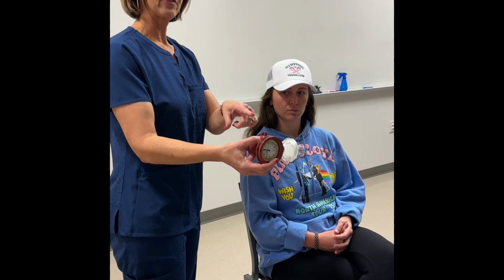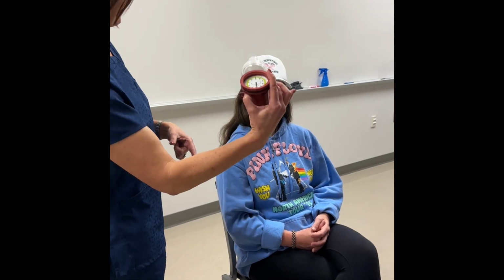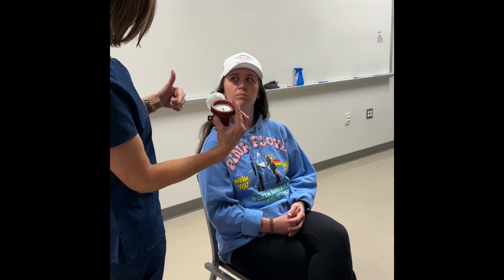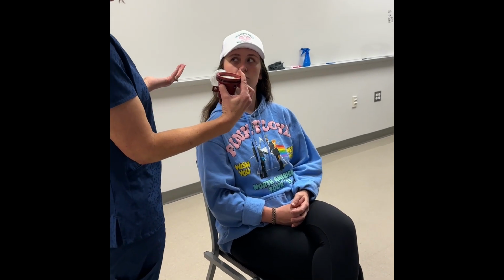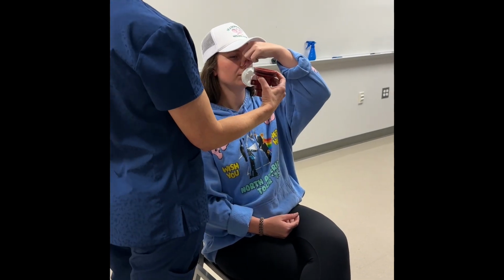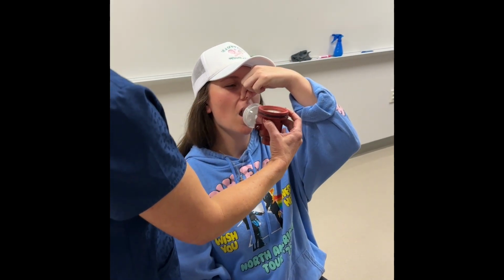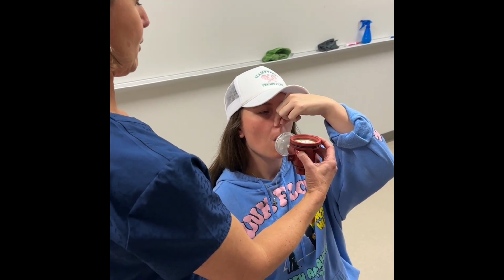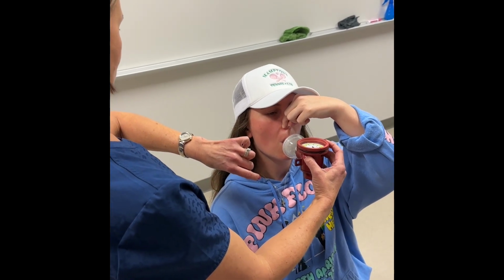I'm gonna hold my thumb on the reset button and I'm gonna say, okay, all I need you to do is put this in your mouth, hold your nose, and just breathe normally in and out. And I'm gonna time you for a minute, okay? Do you want me to hold it? No. Okay. And you just breathe, and when I'm ready, I'll start the clock.